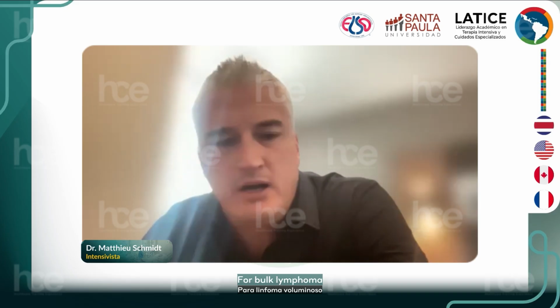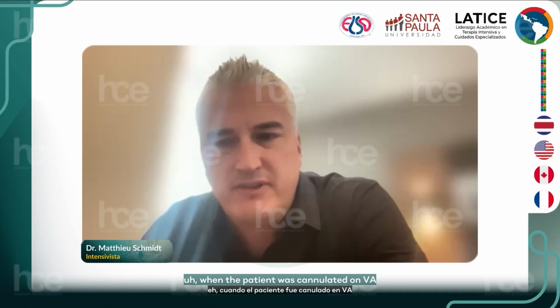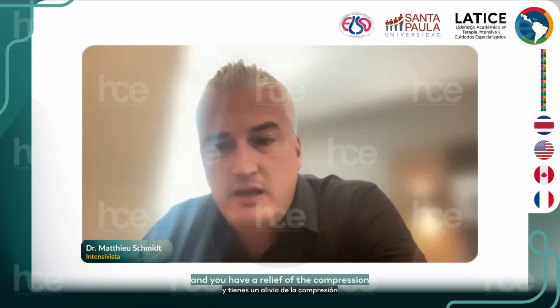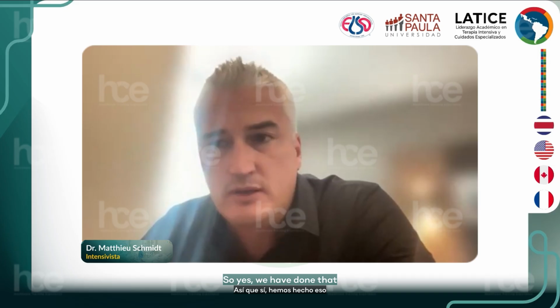For bulky lymphoma, when you have compression of the pulmonary artery, we have a couple of cases where the patient was cannulated on VA to support the RV and the heart function, more than the lung function, in fact. Doing chemo on ECMO, we then saw the tumoral mass progressively decreasing, with relief of the compression of the pulmonary artery, leading to the possibility to wean from ECMO. So yes, we have done that.